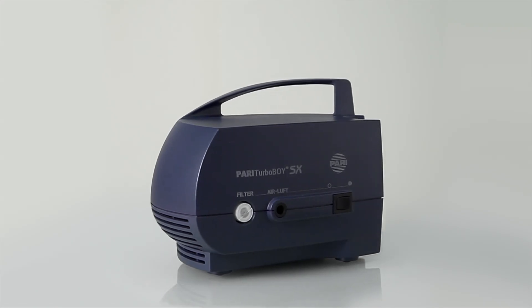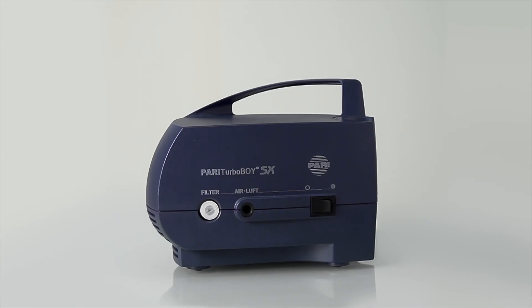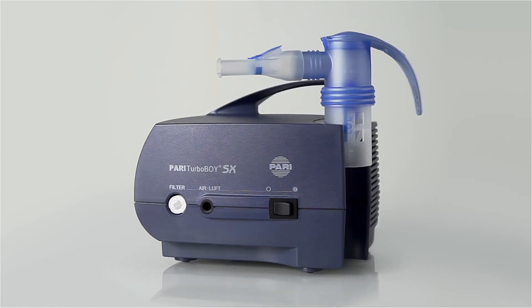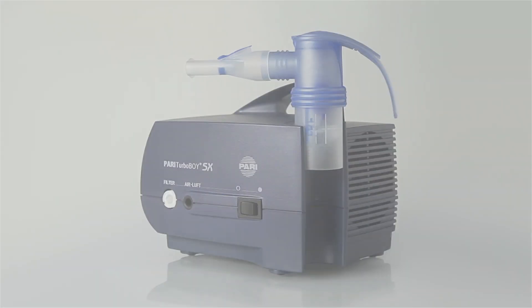Your Pari Turbo Boy SX consists of the Pari Turbo Boy SX compressor and the Pari LC Sprint Jet Nebulizer. These two components are designed to function together perfectly, and they work as a team to support your inhalation treatment.